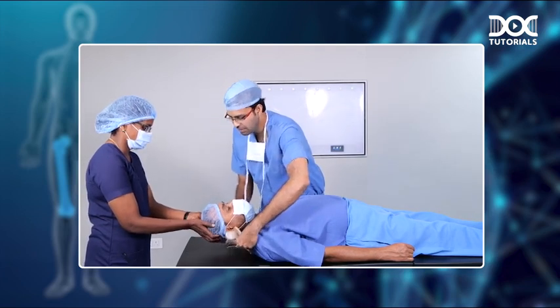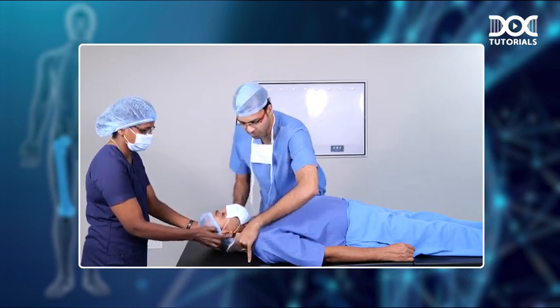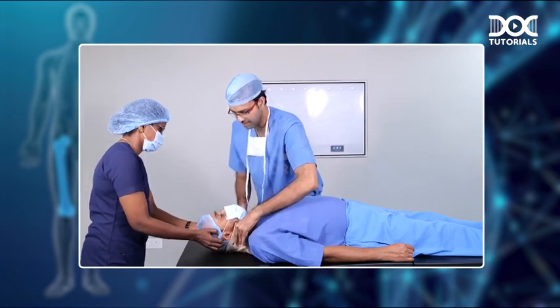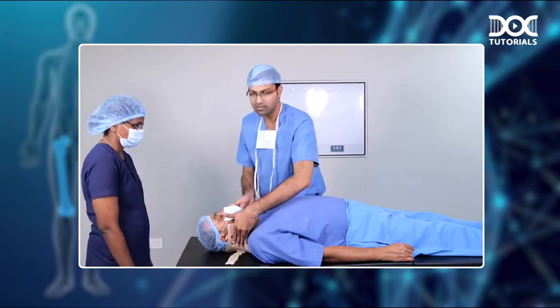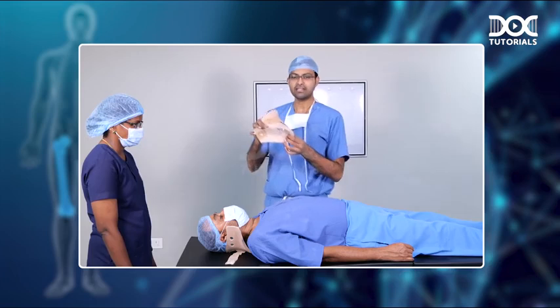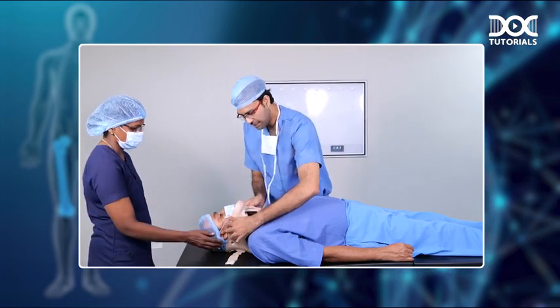Then you ask the assistant to leave the head. Now you can see that the cervical collar is almost in place. Then you can gently slide it in like this. So you don't have to manipulate the neck too much and the posterior part is already in. Once you do that, you can apply the anterior part like this. This will go all around the neck.